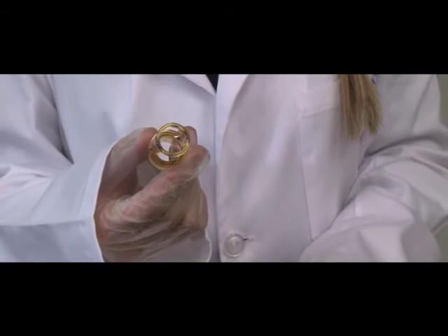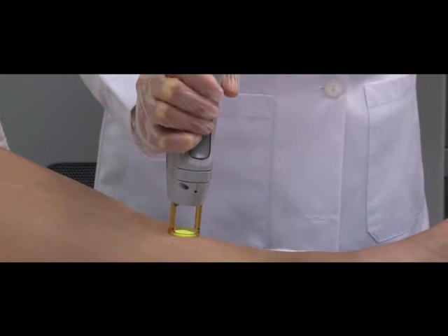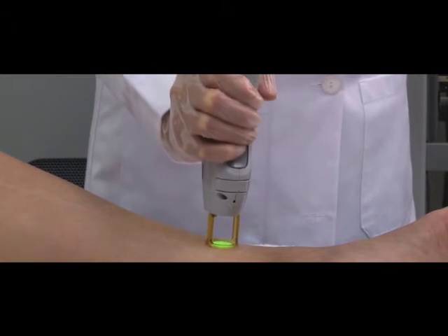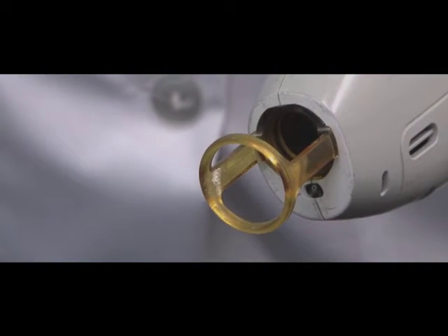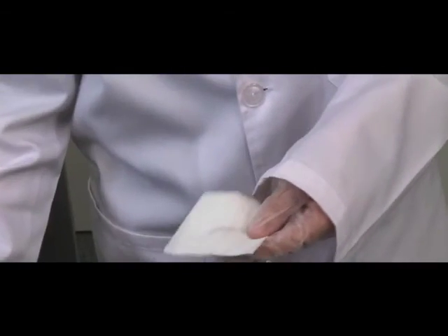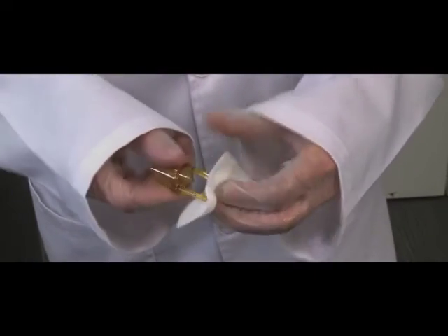A clean window and fresh gauge can be quickly and easily attached. Also during the treatment, keep the distance gauge free of any frost from the cryogen by quickly wiping every 30 to 40 pulses. And, of course, clean with isopropyl alcohol or medical wipes between patients.